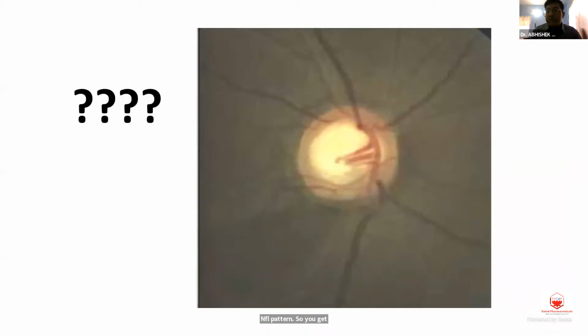At this point of time, let me stop for this question, if any PGs can interact, because this is supposed to be an interactive session and not a didactic or a Socratic one. So you can see a glaucomatous disc with cupping, nasalization of vessels, and this arcuate defect in the inferior part. So can anyone comment on where you are going to find the field defect to perform a perimetry? Just 5 seconds if any PG can answer, or we will move to the next slide because of paucity of time. Even please.